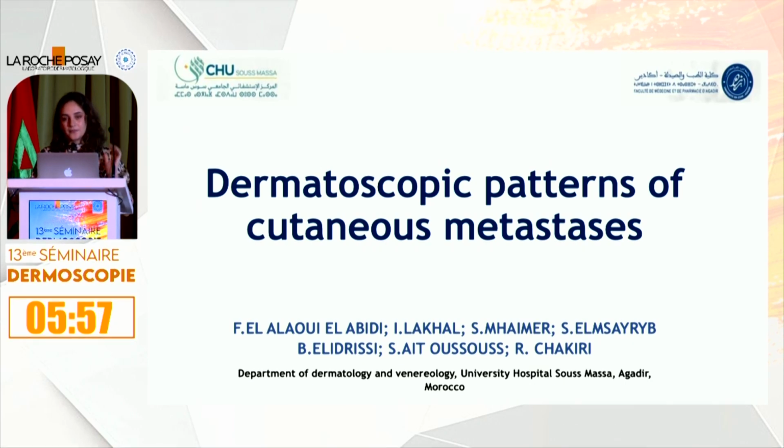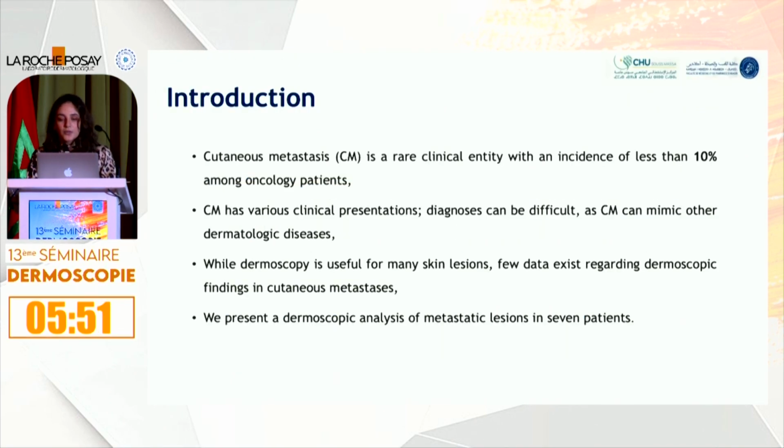Good morning. In our presentation, we will discuss the dermatoscopic patterns of cutaneous metastasis. Cutaneous metastasis is a rare clinical entity with an incidence of less than 10% among oncology patients. Cutaneous metastasis has various clinical presentations. Diagnosis can be difficult as cutaneous metastasis can mimic other dermatologic diseases.